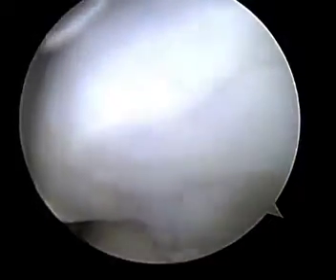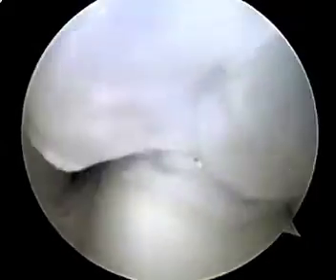A 30 degrees arthroscope was inserted from an anterolateral portal. Soft tissues around the talus were removed with a shaver through a medial portal. Then the lateral aspects of the subtalar joint and the calcaneofibular ligament were visualized.